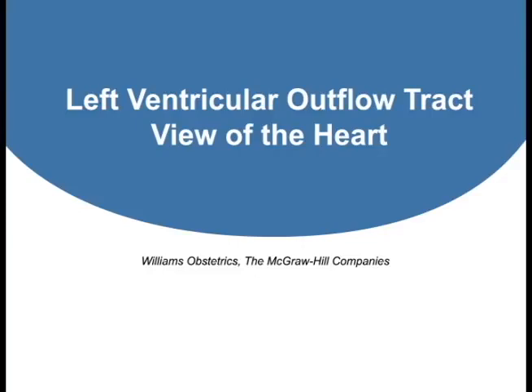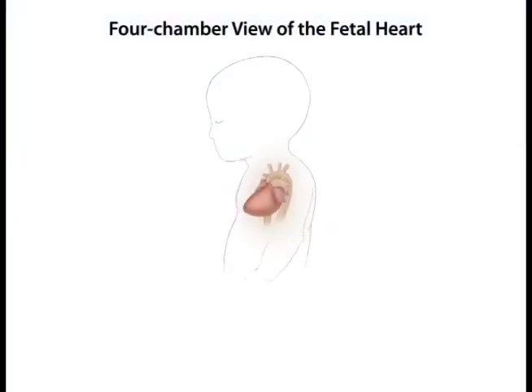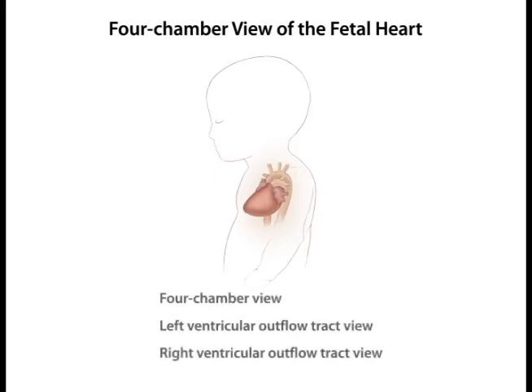Left ventricular outflow tract view. During standard obstetrical ultrasound evaluation, several views are used to image desired cardiac anatomy. The 4-chamber view is obtained during every standard examination. If technically feasible, a left ventricular outflow tract view and a right ventricular outflow tract view are also obtained. The left ventricular outflow tract view is described here.